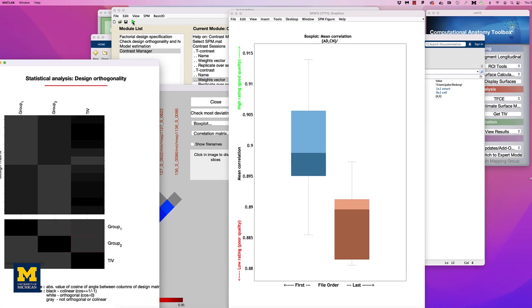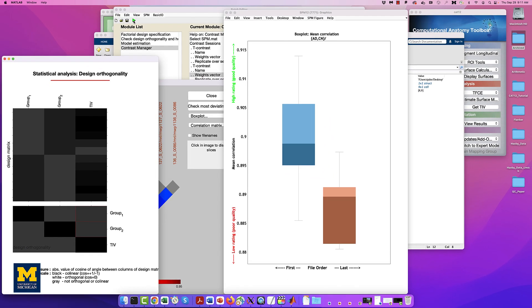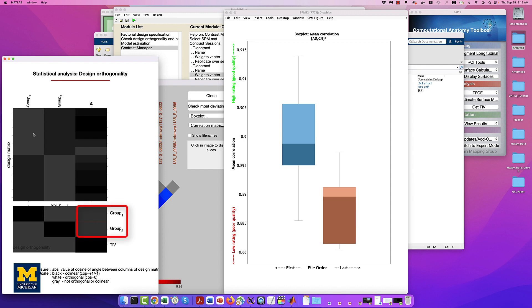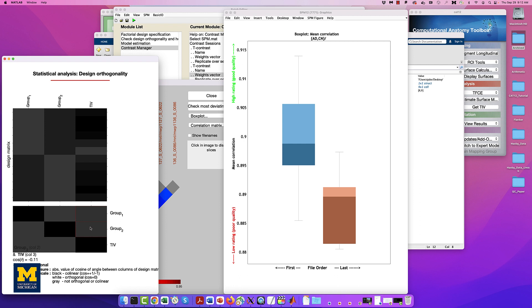Now click the green Go button, and you should see the following graphs. This will generate a few pop-up windows, one of them showing the box plots and the correlation plots that we saw in the previous video. For now, we're going to focus on the design orthogonality window, which shows your design matrix on the top half and correlations between the regressors on the bottom half. The boxes highlighted in red represent the correlation between your covariates, in this case, TIV, and the other regressors in your model. Left-click on them to see how large the correlation is. In this case, it's about .11, which is relatively small, and we can go ahead with our analysis as usual.